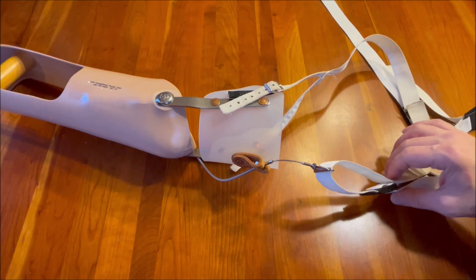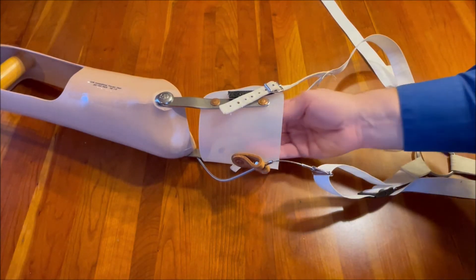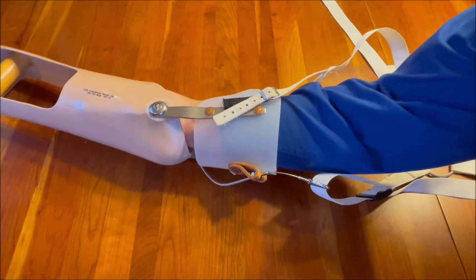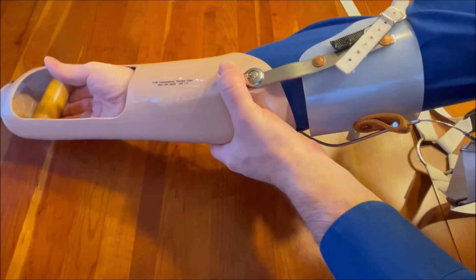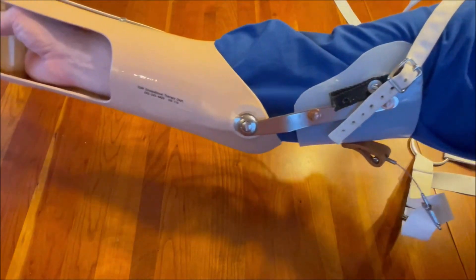What you want to do is put your right arm in between the Y yoke above and the wider strap below, and all the way into the forearm socket and grab the wooden handpiece.